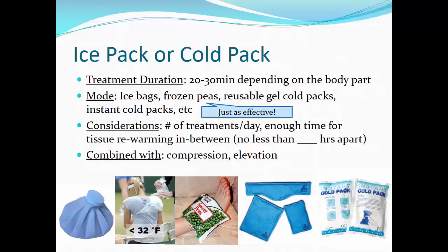We need to be very cautious with reusable chemical packs. It has been documented that these cold packs can get as cold as 12 degrees Fahrenheit and therefore is much colder than ice. The body does not always recognize this cold as being colder than ice. These treatments should have a barrier between the patient and the ice pack to reduce the incidence of chemical burns.